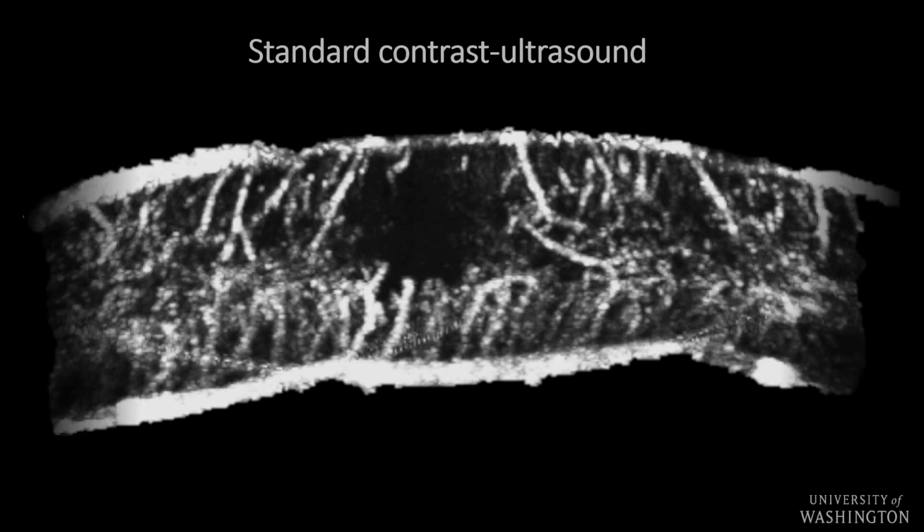Another example is contrast ultrasound, and in particular super resolution contrast ultrasound, where we try to predict, say, the sparse distribution of microbubbles and the locations of the microbubbles from the diffraction limited images. And the way we do this again with model-based deep learning, I will not go too much into detail now for the sake of time, but the principle is the same again.